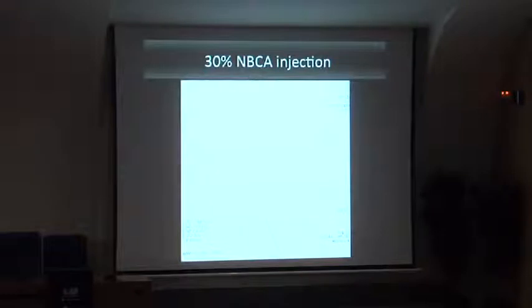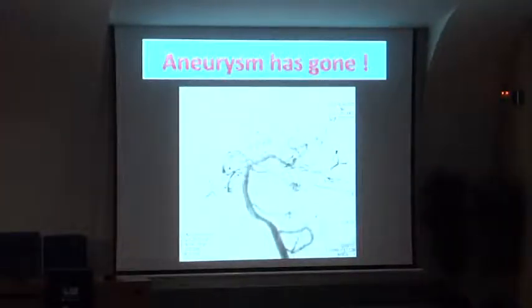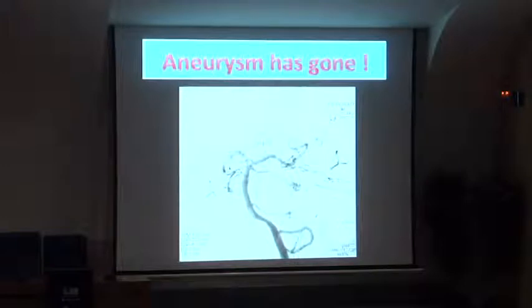So just after the angiogram, the aneurysm has gone. Just after AVM embolization, the aneurysm has gone. Honestly speaking, I was surprised to see the angiogram.